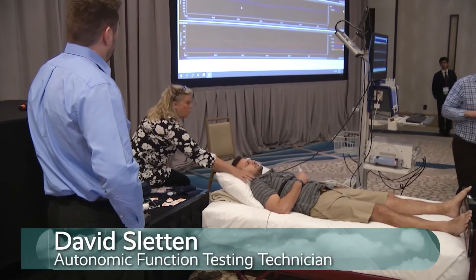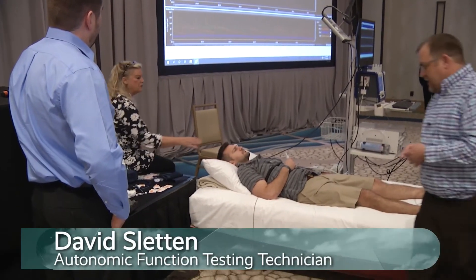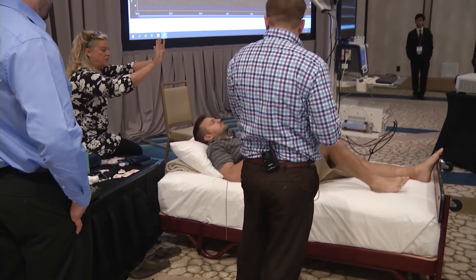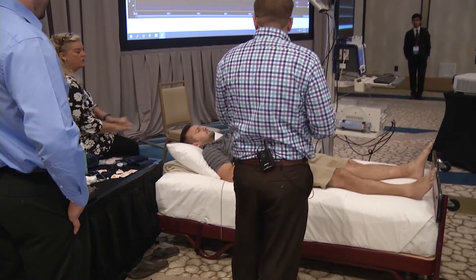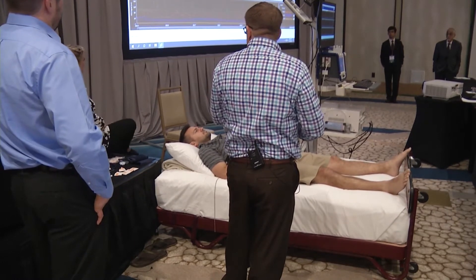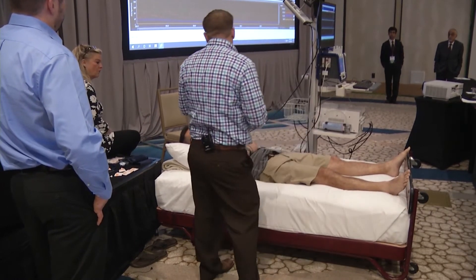I'll explain to Jade what we want him to do for this test. I'm just going to have him move his feet up a couple inches. You don't want him pushing his feet against the floorboard. You want him to keep his muscles really relaxed and use his tummy muscles, because you want to reduce the volume.